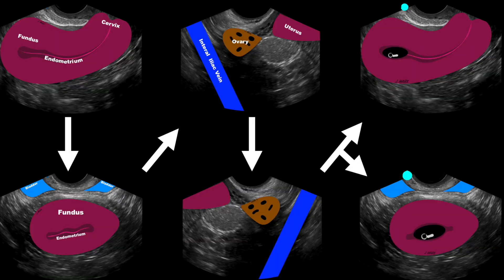In summary, on our transabdominal exam: we have no identifiable intrauterine pregnancy, no identifiable ectopic pregnancy or masses, and we do have some free fluid in the pelvis but none in the right upper quadrant. Our next step is performing a transvaginal exam. We'll have the patient urinate, perform a pelvic exam if indicated, and then continue with the transvaginal ultrasound.